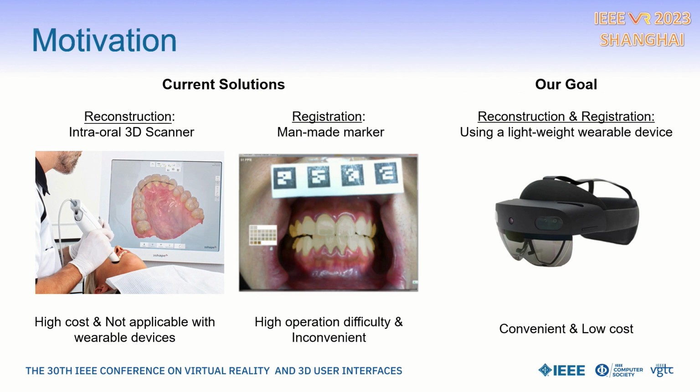Existing solutions require the use of expensive intraoral 3D scanners to digitally reconstruct the oral cavity and require prefixed man-made markers for registration. These methods increase the cost of treatment and increase the difficulty of operation. Our goal is to use wearable AR glasses, such as HoloLens 2, as the only sensor, combined with cloud processing, to integrate reconstruction and registration, reduce reconstruction costs, and facilitate use.